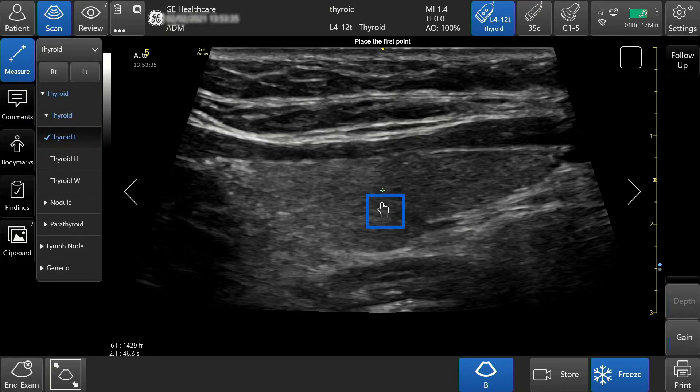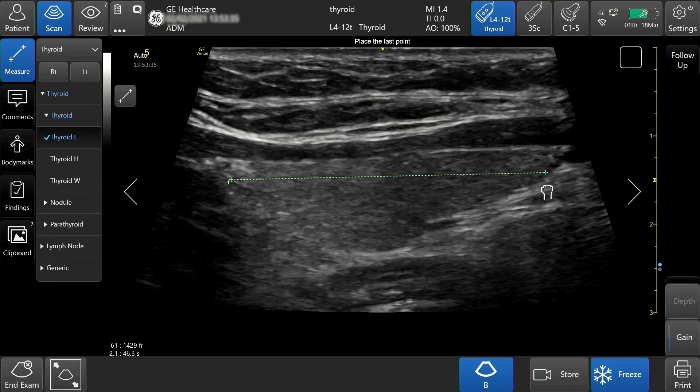Tap on the hand to move it to its desired location, tap to set your first point, then drag the hand and tap on the second to lock the measurement.